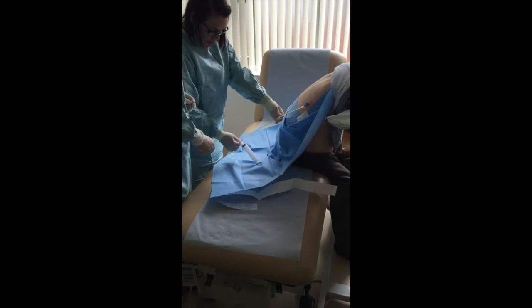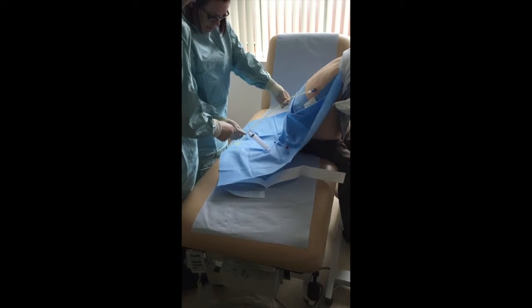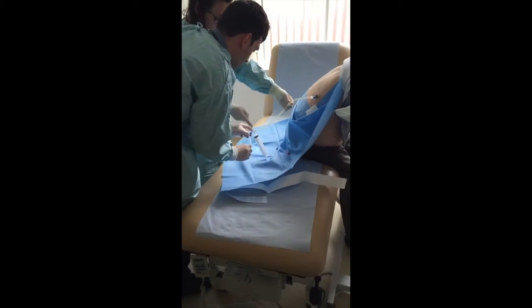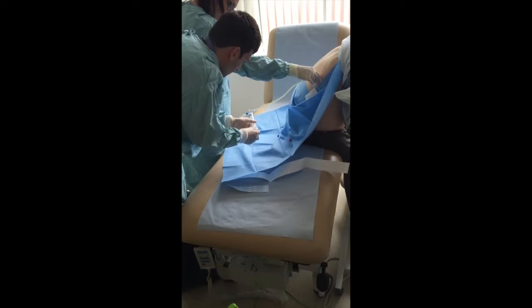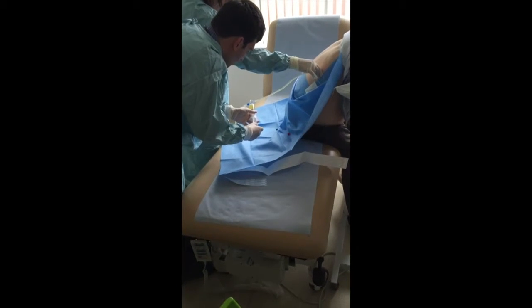Okay. So wherever the blank is on the 3-way tap is in the off position. So turn the blank off to the bag at the bottom, so turn that 3-way tap round so it's closed to the bottom. Okay, and then just aspirate with the syringe. And it's quite tough, there's a lot of pressure to do it. And actually this is the way that we were taught how to do it previously, but mostly gravity does all of the work for you.